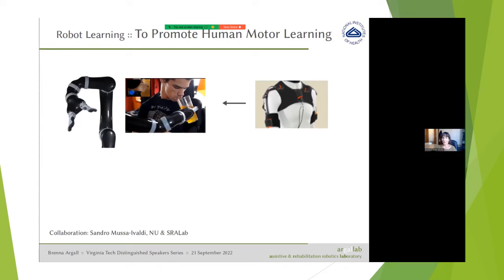You know, in the very obvious ways to break down shoulder motion, it's easy to think of how you could do it with 4 dimensions, but if you're going to do something like 6 dimensions, you'd maybe need to couple motions. Also, our patient population maybe doesn't have these clear axial movements. So it was unclear to us whether it's even possible to do this. But the whole idea was that we would use robotics autonomy to help with training the human, help with their understanding of learning how to operate a high dimensional assistive machine with a high dimensional interface.